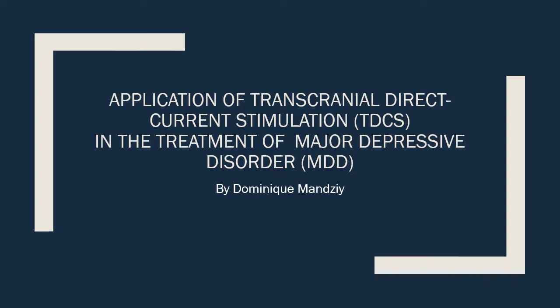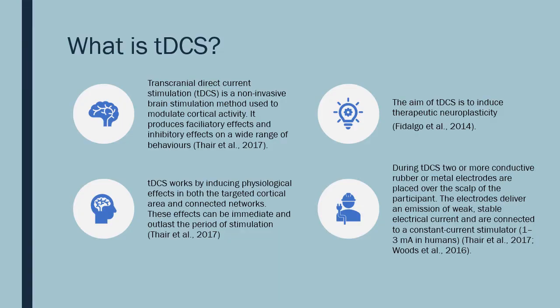The application of transcranial direct current stimulation in the treatment of major depressive disorder. tDCS is a non-invasive brain stimulation method used to modulate cortical activity. It produces facilitatory effects and inhibitory effects on a wide range of behaviors. The aim of tDCS is to induce therapeutic neuroplasticity.